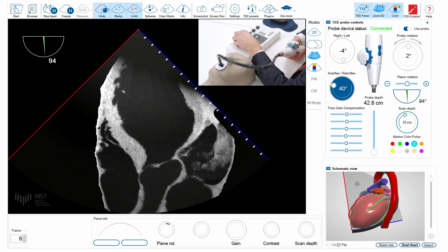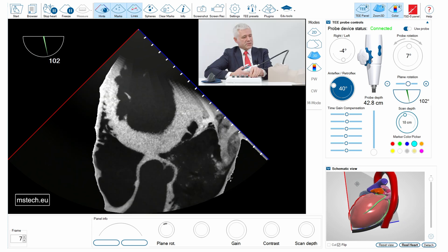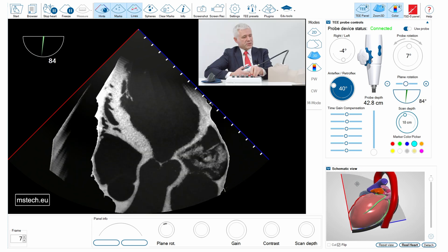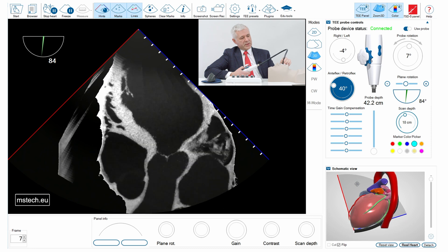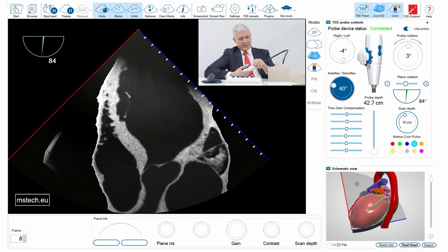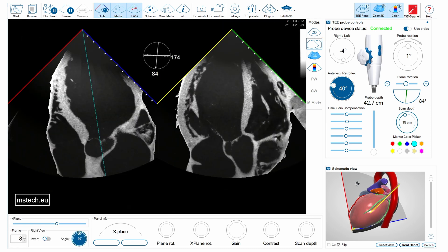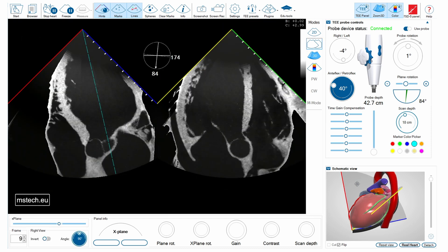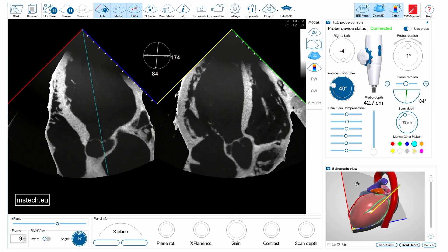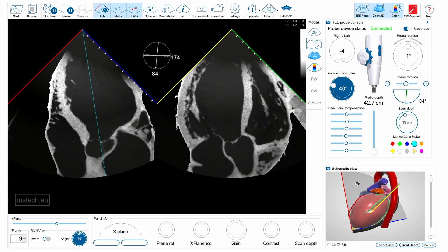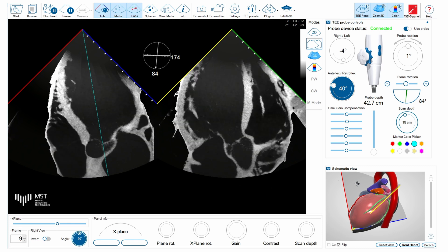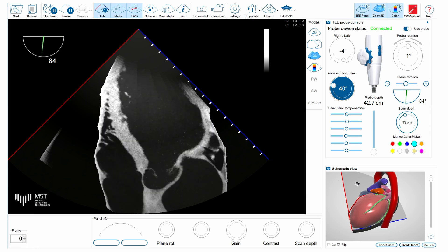Here you see the long axis view of the aorta visible in far field, and obviously you can use the x-plane function also to understand anatomical aspects of this patient.